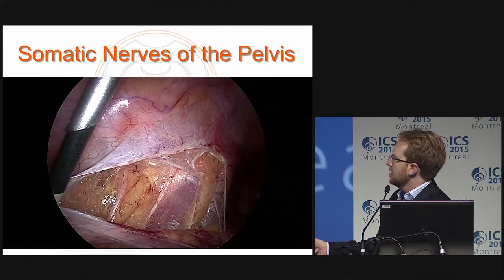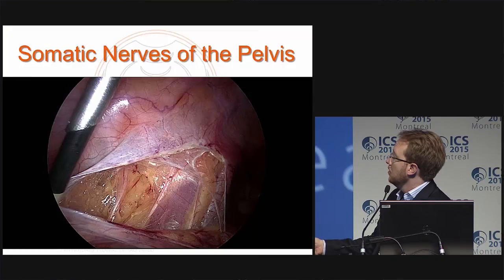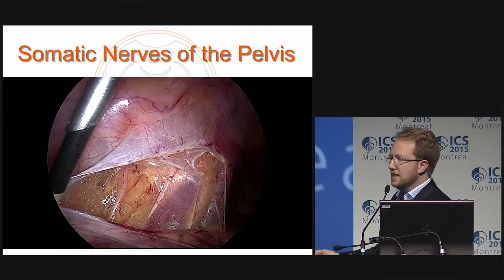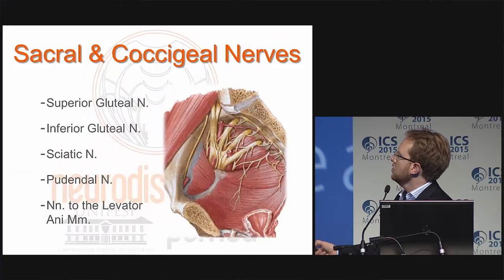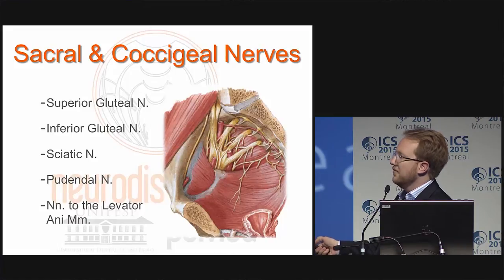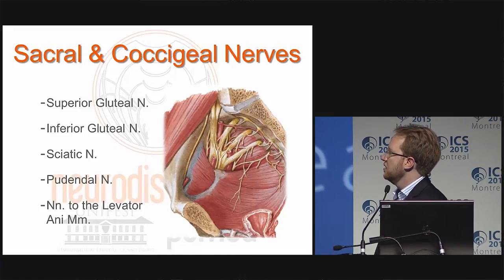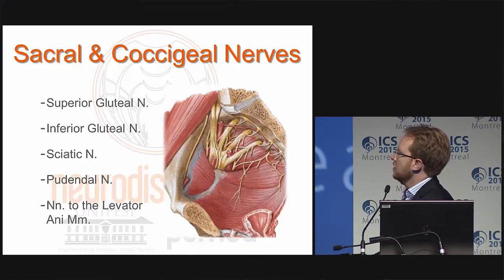This is the psoas muscle. These are the external iliac vessels. This is the iliohypogastric, ilioinguinalis, and genitofemoralis on the left side, very close to the peritoneal surface. We can also have access to the superior gluteal, inferior gluteal, sciatic nerve, posterior cutaneous femoralis nerve, pudendal nerve, and the nerves to the levator muscles.